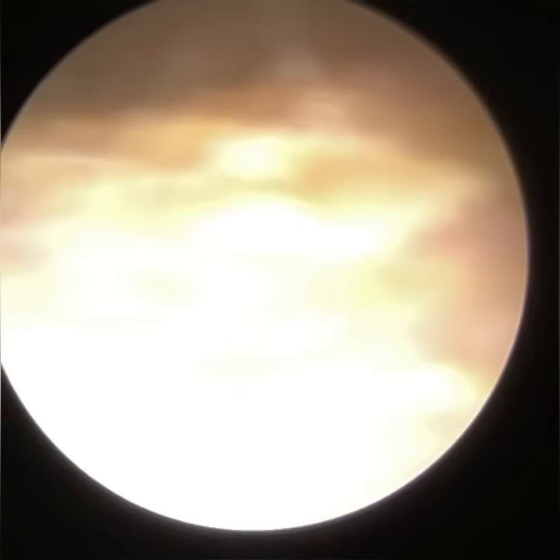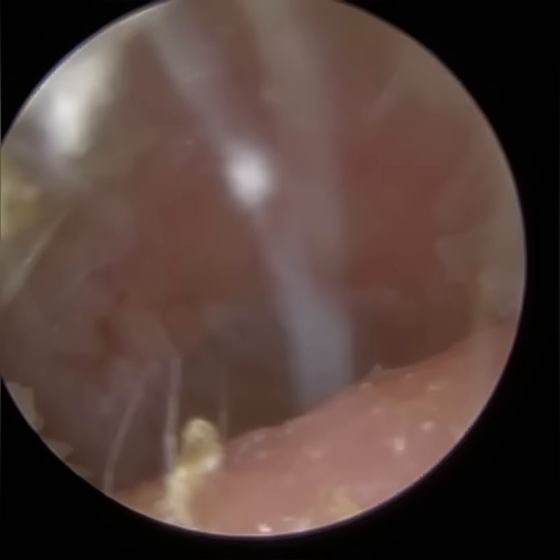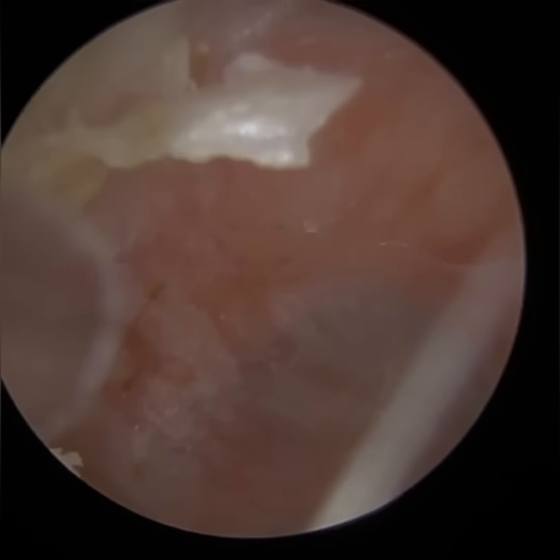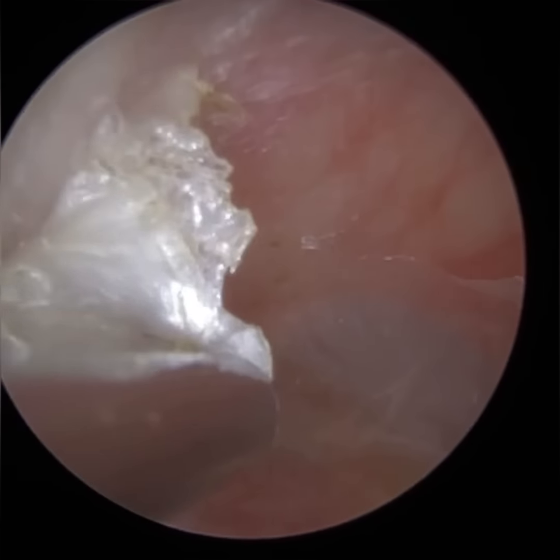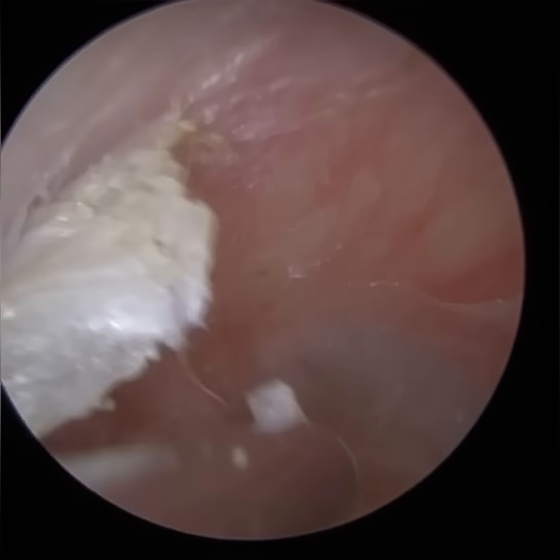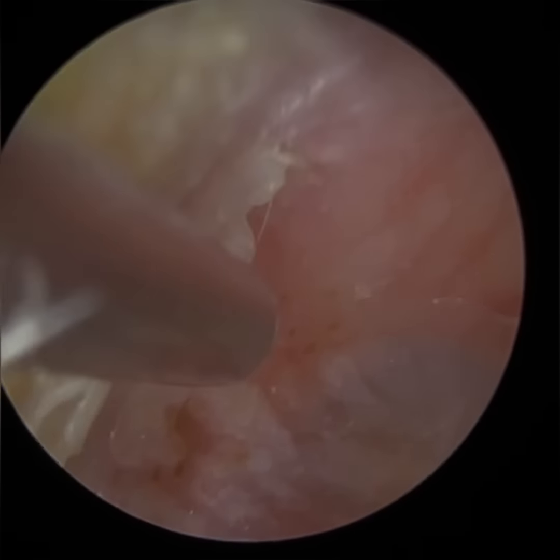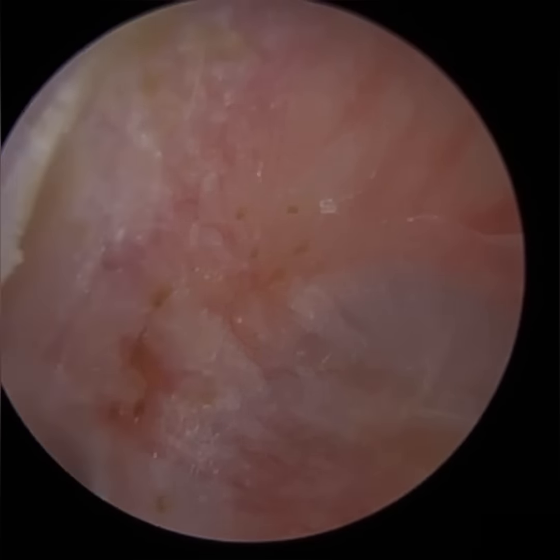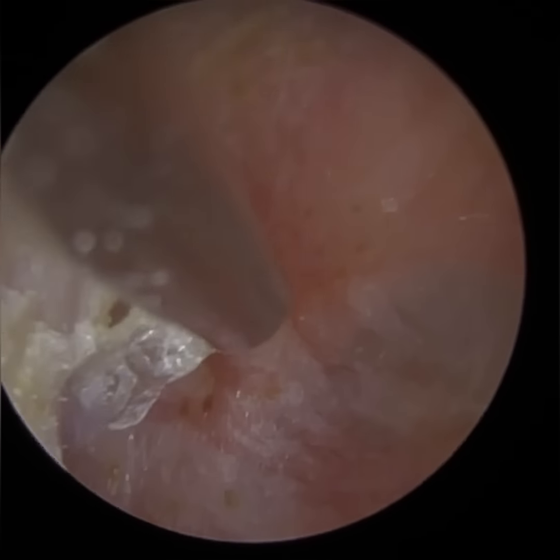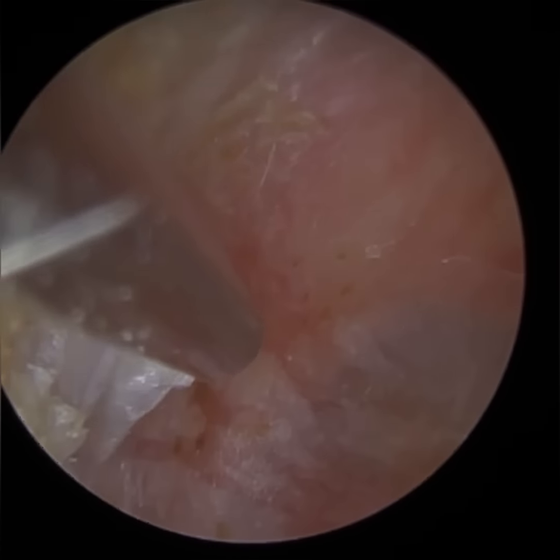So nearly there, and you can see here in particular it's extremely itchy at the entrance — they were scratching away at it, so there's a bit of a scab there. It's just not possible to get every little piece of skin out — this patient's ear is already tender. We're getting a little bit of clarinetting as well. Right up against the eardrum at the top now, the roof of the ear canal, so you've got to be really, really careful.